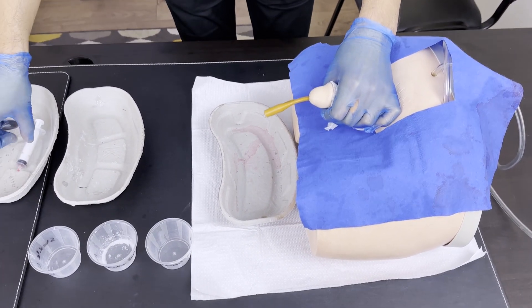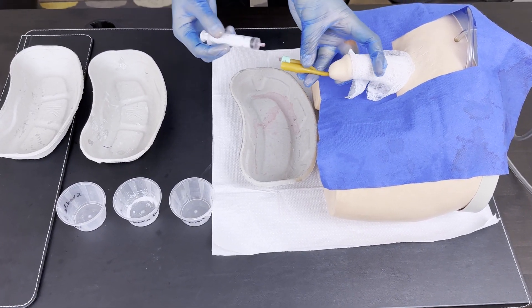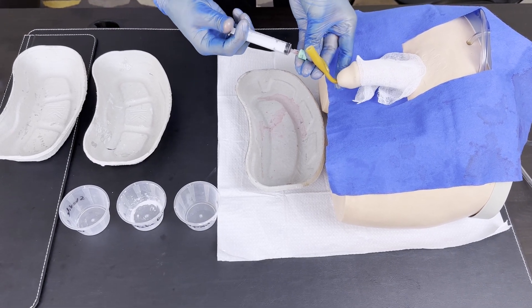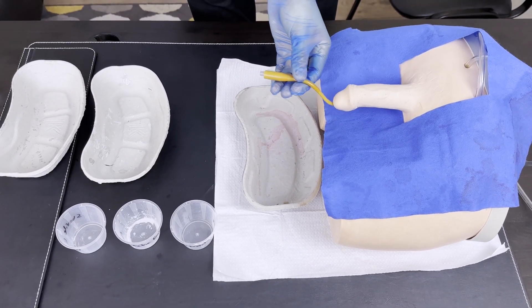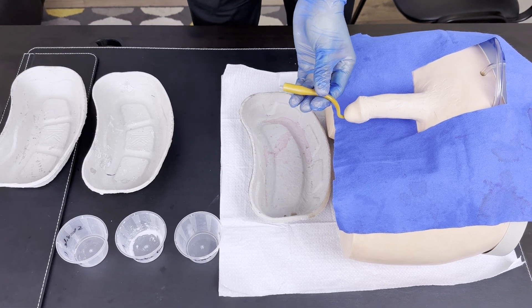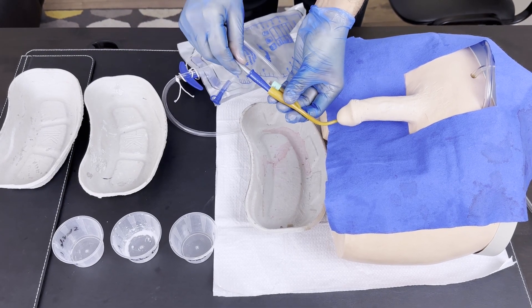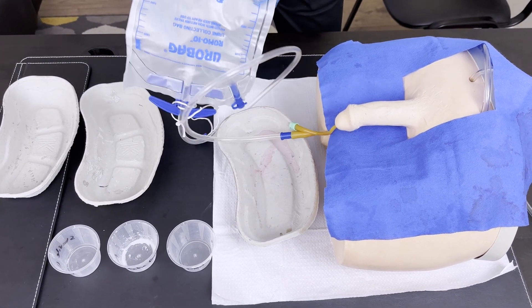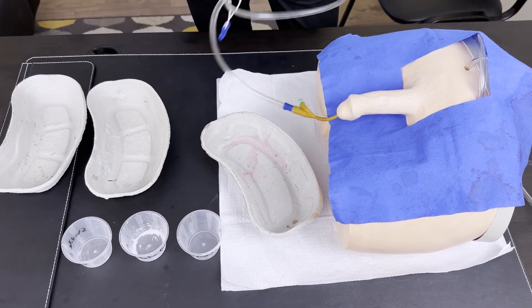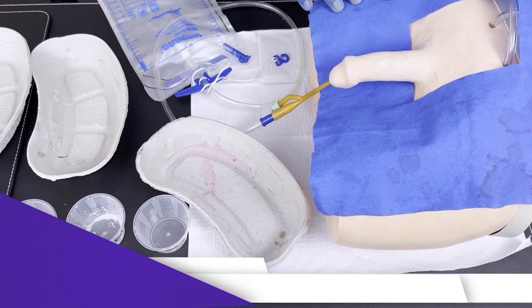Sometimes you will see urine starting to flow. Now take sterile water — usually 10 ml — and inflate the balloon via the port, then tuck it slightly. The next step is attaching the urine bag. Note down the color and amount of urine, put the patient's details on the bag, and hang it on the side of the patient's bed. Finally, make sure you tear the drape as well.